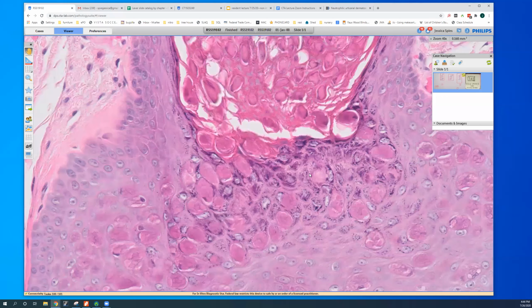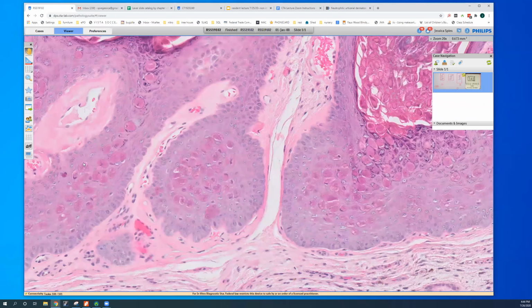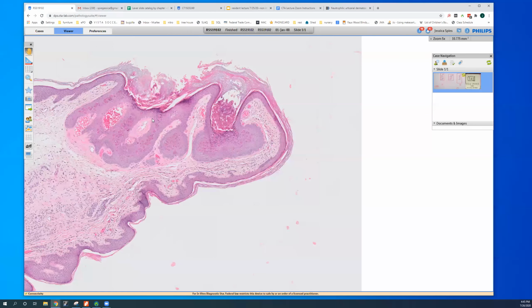Hypergranulosis in a way. And then there are these inclusions that are pushing the nucleus to the side of the cell. I'm sorry, I believe they're cytoplasmic inclusions, pushing the nucleus to the side of the cell. So this is molluscum. And just like imprint this on your brain, this is molluscum. That's exactly what it looks like.